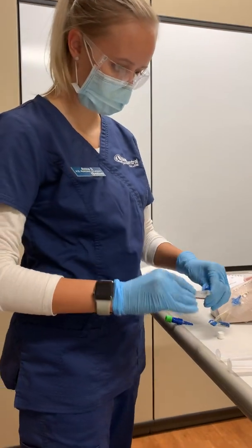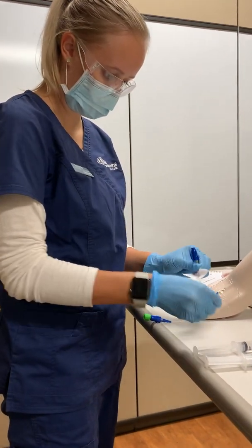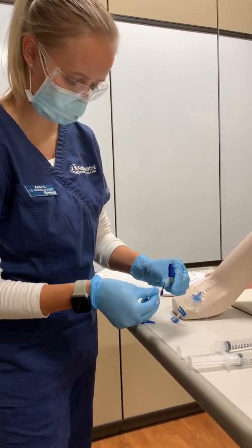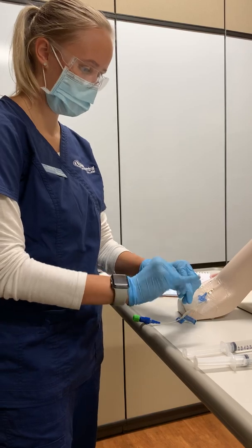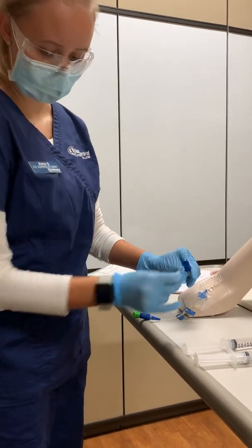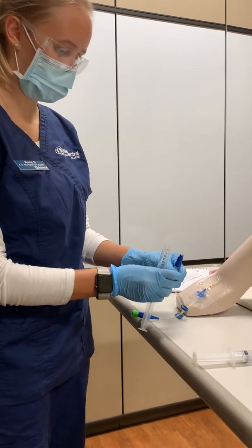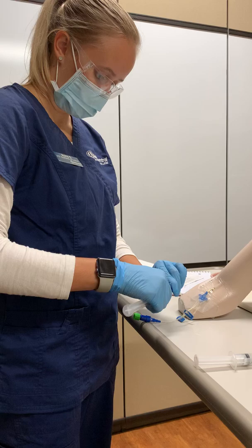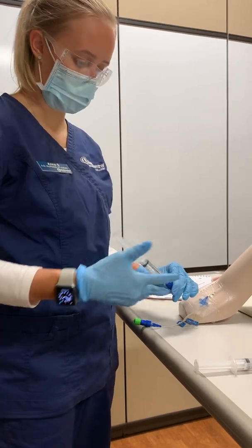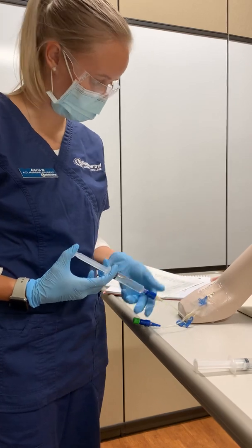Get back up. Clean it off again. And then for the flush right after the medication, I would do it at the same rate as I did the medication, but for now, we'll just give it all again.